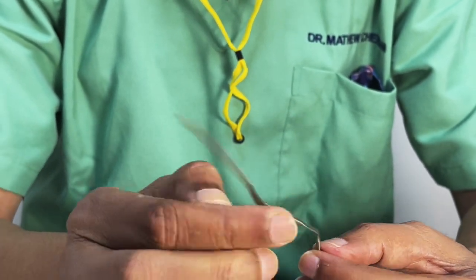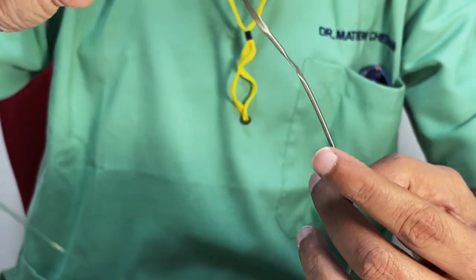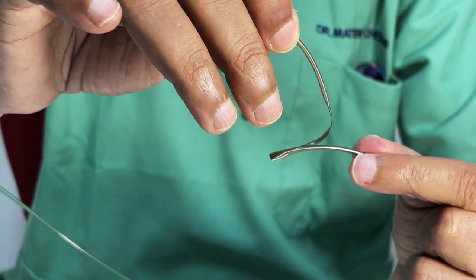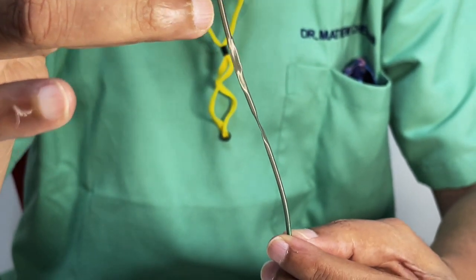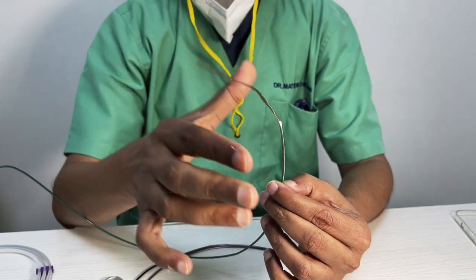Okay, and I'm going to talk to this in greater detail. Now, for example, you're in a situation where you've got a tight loop. It is like this. This is what will happen to the neuron. You understand this problem? So neuron is good. But remember, the problem of neuron is it can get completely deformed. It's become like a ribbon over here.